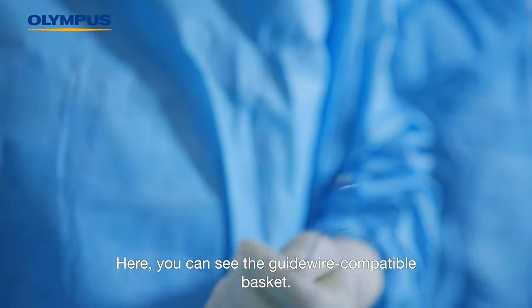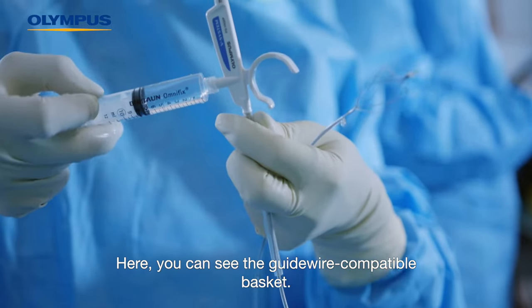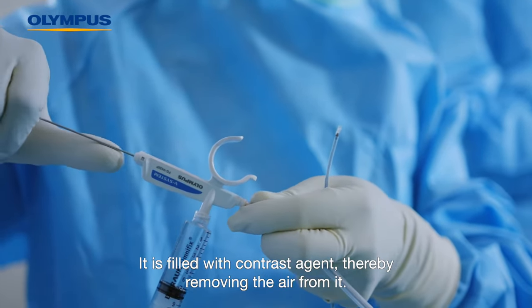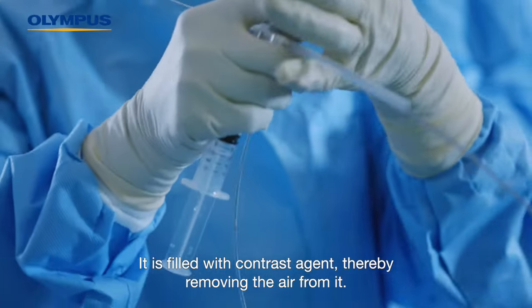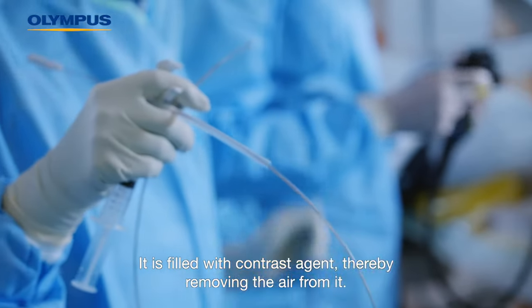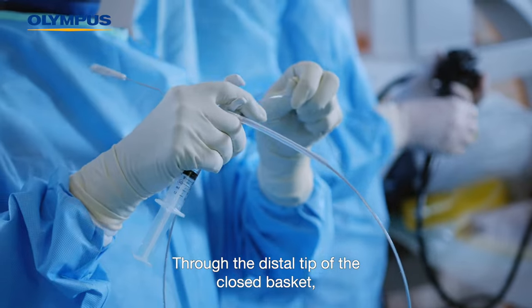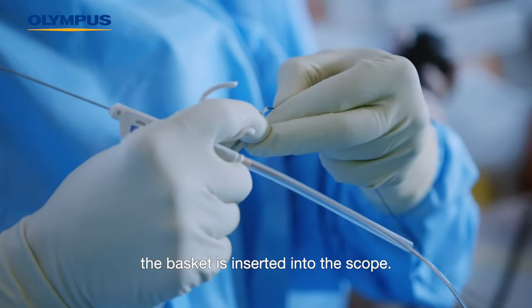Here you can see the guide wire compatible basket. The functioning of the basket is checked and it is filled with contrast agent, thereby removing the air from it. Through the distal tip of the closed basket, the basket is inserted into the scope.